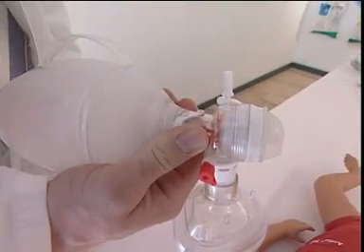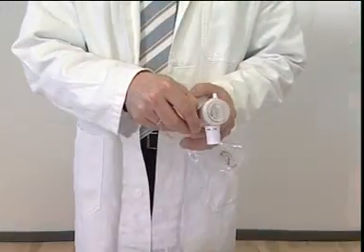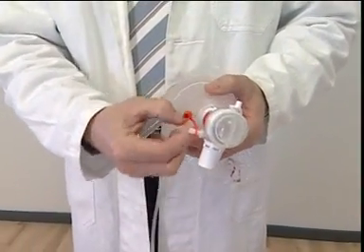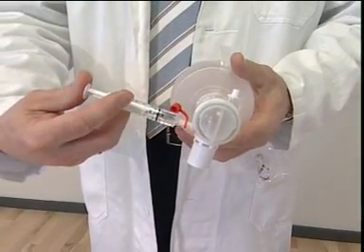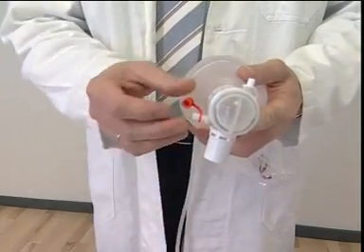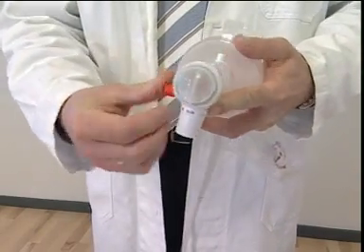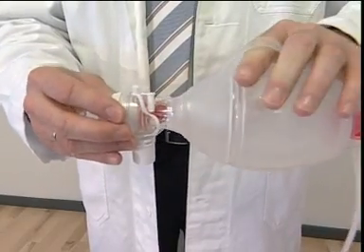When using an endotracheal tube, the Mediport can be used to administer medication without disconnecting the SPUR II from the tube. The administration of medication could be done by removing the Mediport cap, mounting the syringe in the Mediport, and injecting the medication. When medication has been injected, ventilate 5 to 10 times in quick succession.